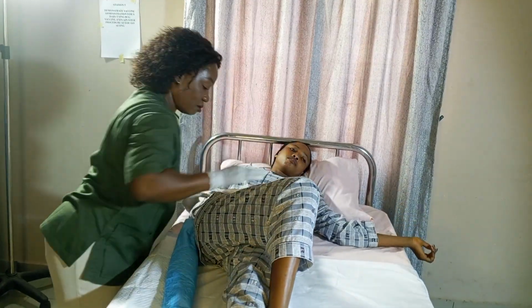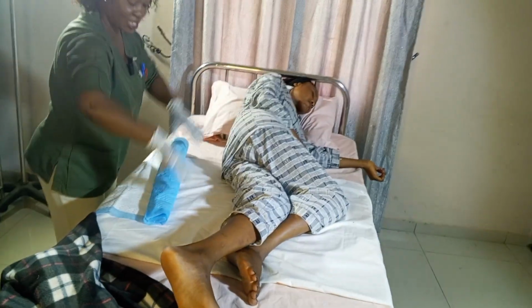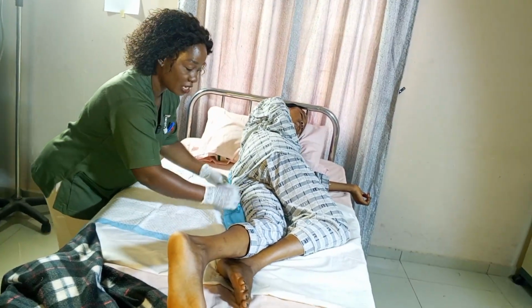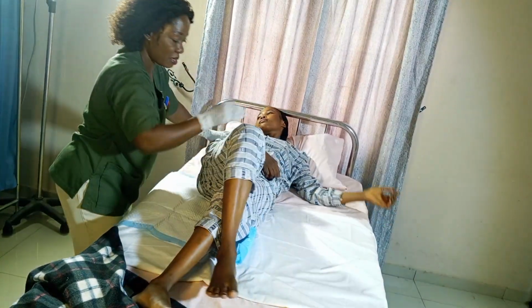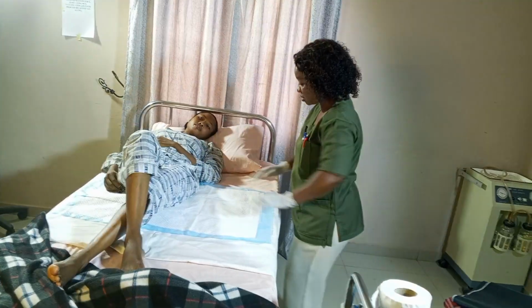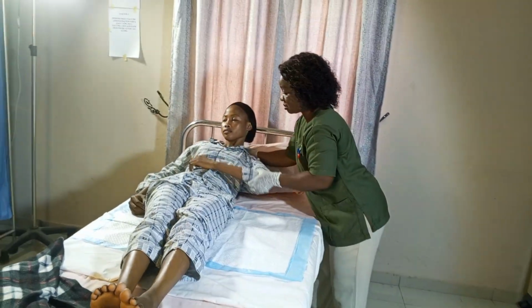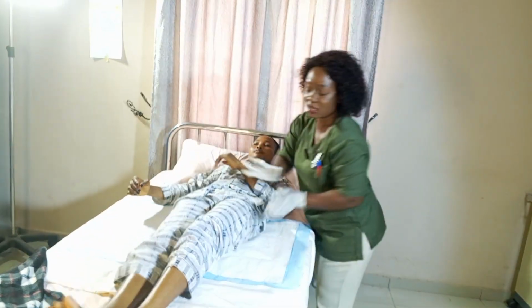So now you have to place this box, and I turn this patient this way. I ask the patient to place her leg, and I turn. Can you see the importance of flexing the leg now? The patient is on the other side, and I try to push the underpart towel under the patient's buttocks, and again I assist my patient to come back towards me, and I arrange the drape. Continue this way, and I assist my patient to place her legs straight, and I assist her back to the middle of the bed.